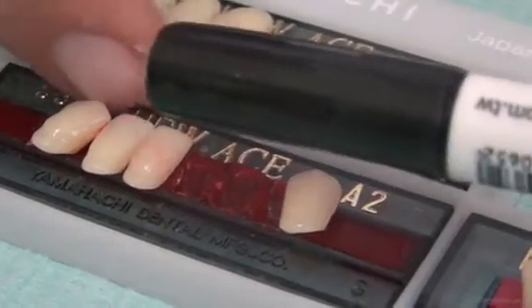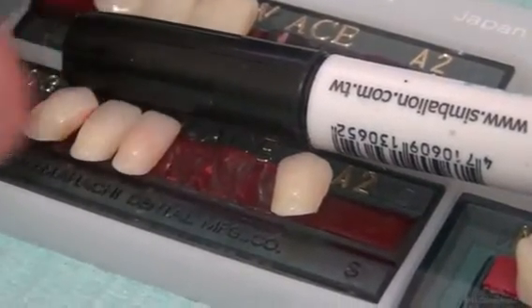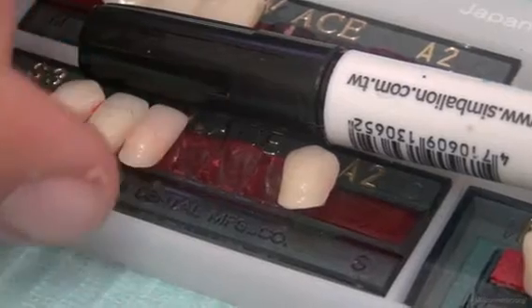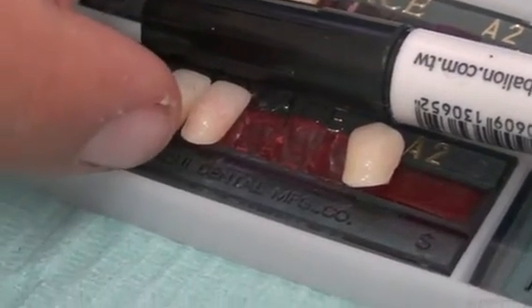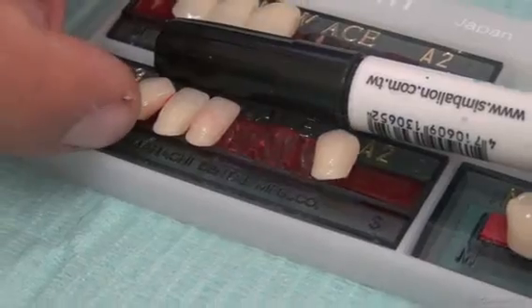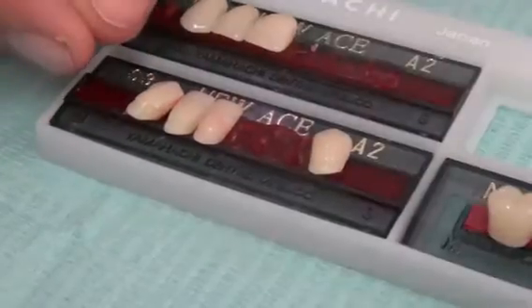Taking that the incisal edges are straight, the roots are not. The roots have different positions. They have different angulations. Slight distal angulation for the lower central, more distal angulation for the lateral, and more distal angulation for the canine. How do I determine how much I angulate it?